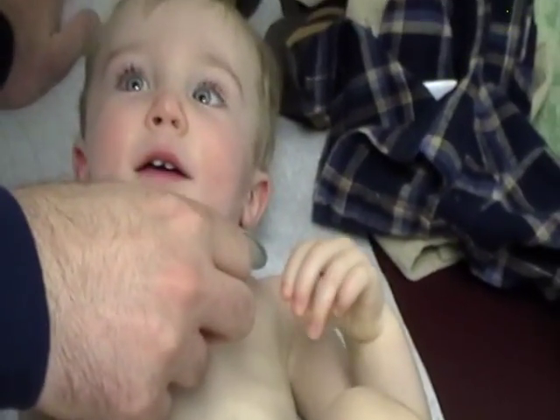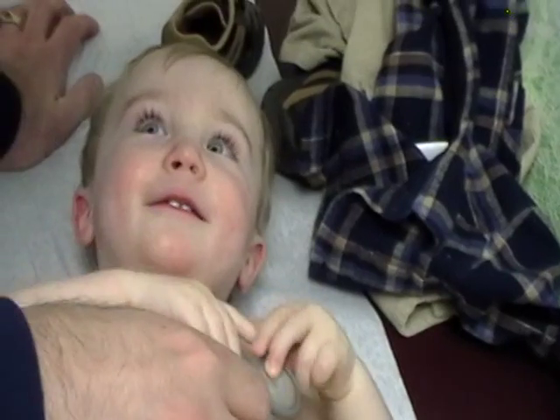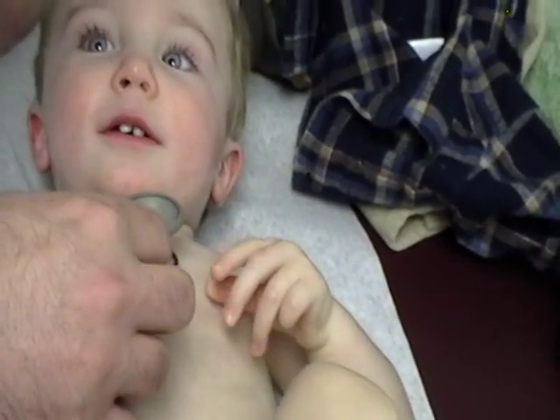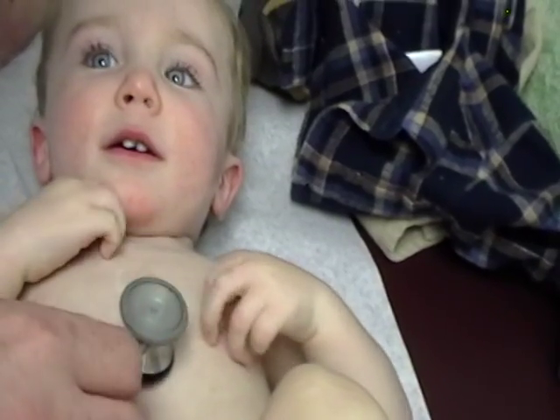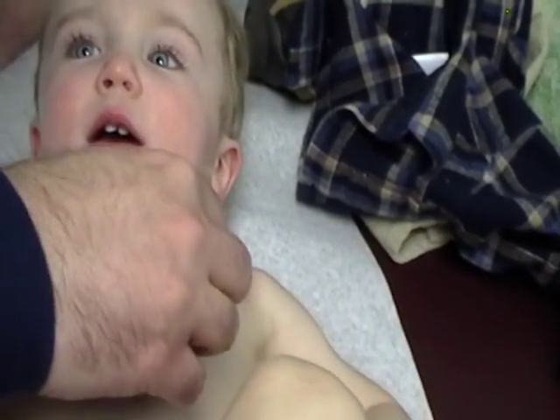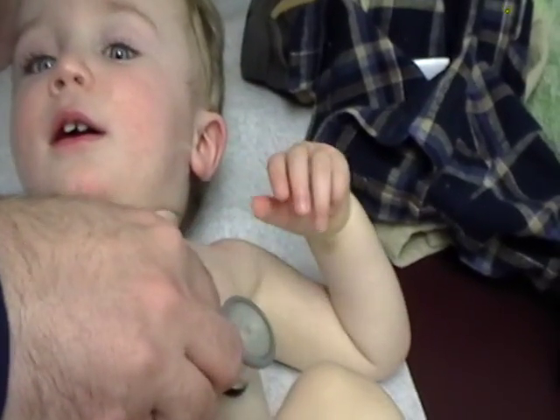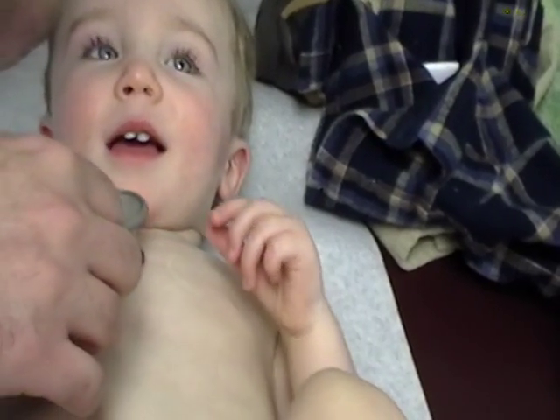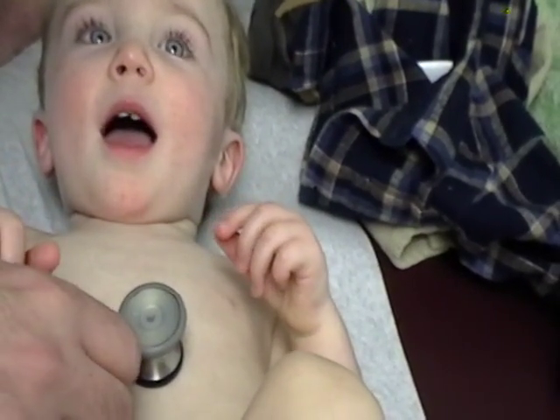Now we're going to auscultate. When you're auscultating for heart sounds, I strongly recommend using the bell. Everybody tends to get fixated on the diaphragm, but you miss the lower frequency chest sounds — specifically, you're going to miss some of the low frequency murmurs. Remember, you can turn the bell into a diaphragm simply by sealing the bell off on the chest.